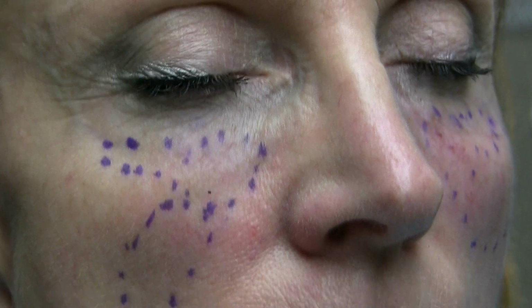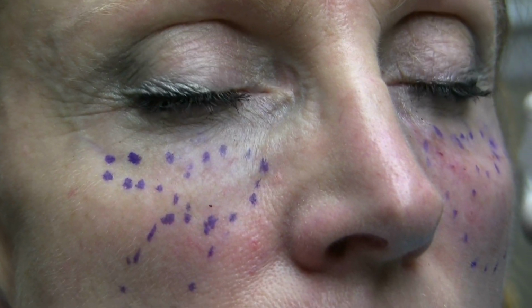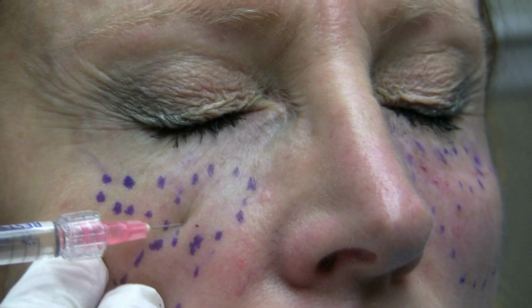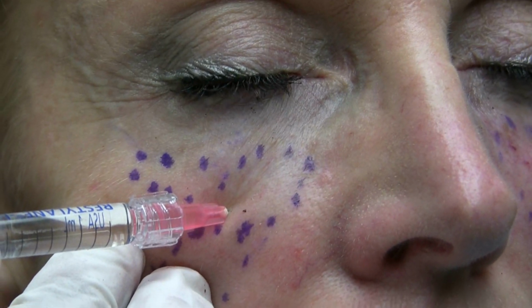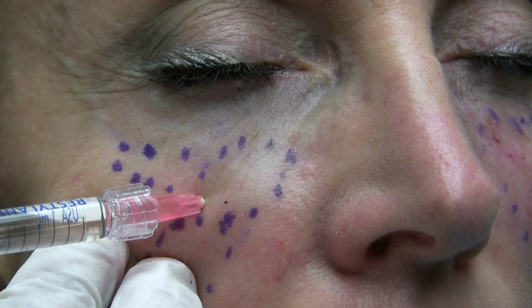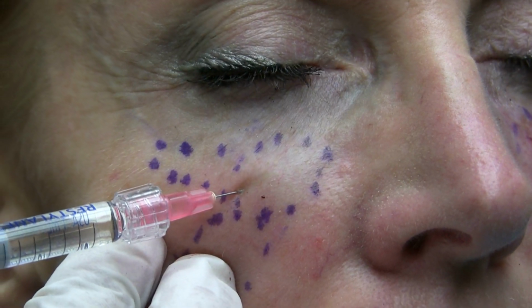I want to be in the periosteal region. So I want to be deep for sure to the orbicularis oculi muscle. And so we're going to go back here, and we're going to slowly inject. And I'm using Restylane for this injection. You can see how nice it's plumping.